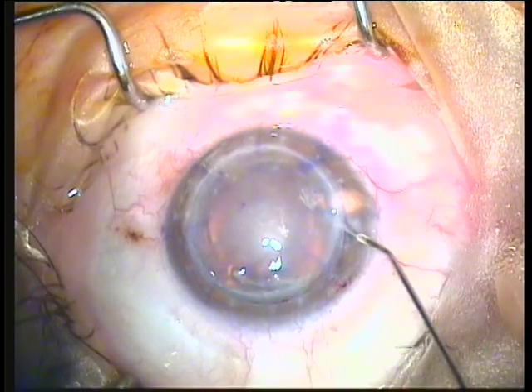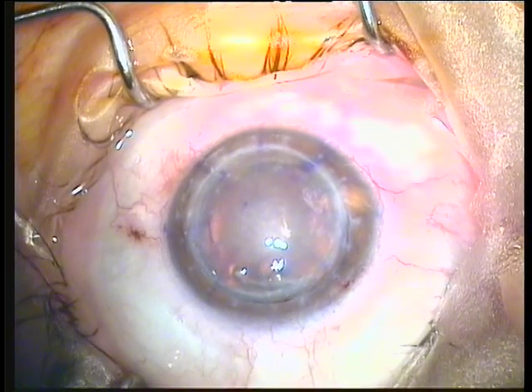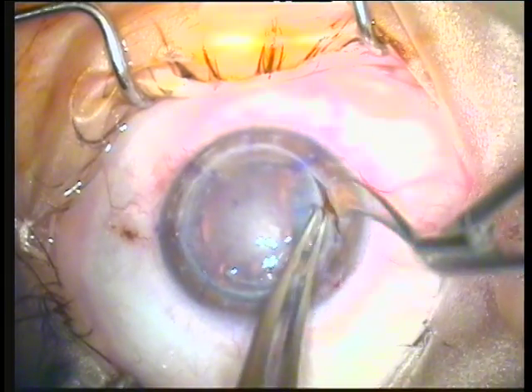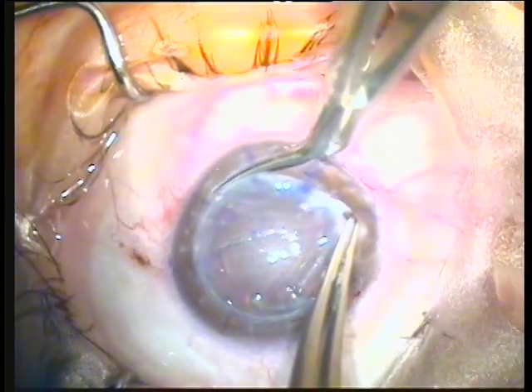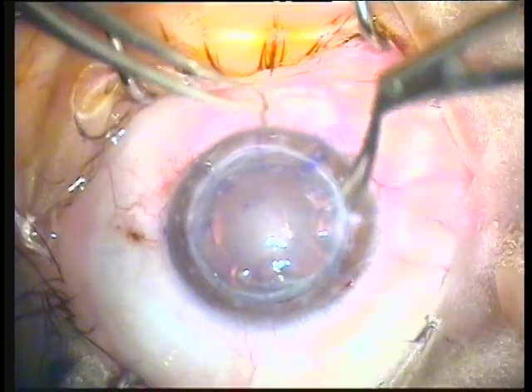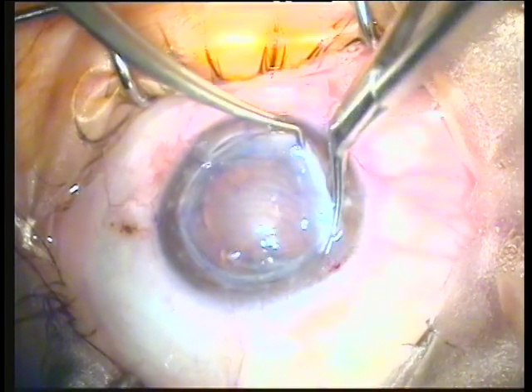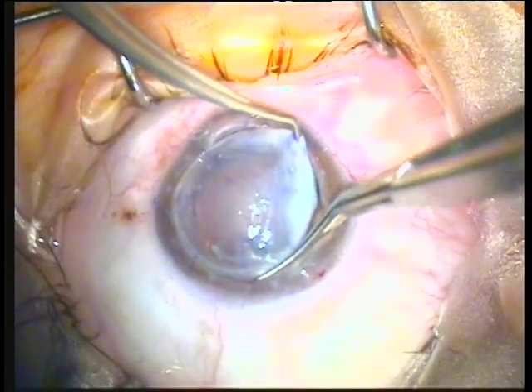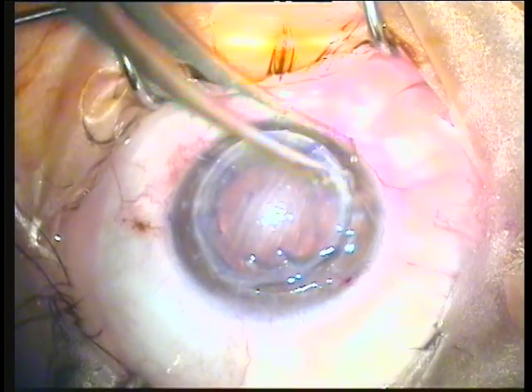A keratome is used to enter the anterior chamber, and then viscoelastic is used to fill the anterior chamber and avoid injury to the iris and the crystalline lens — which is now a cataract — with the Casariejo cornea scissors seen here. Cutting the pre-trephined tissue, always entering sideways to avoid injury of the iris, then bringing the scissors vertical to get a clean, straight cut guided by the gutter created by the trephination of the host tissue.